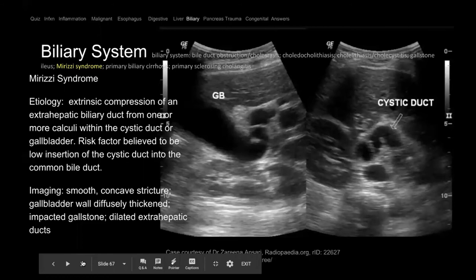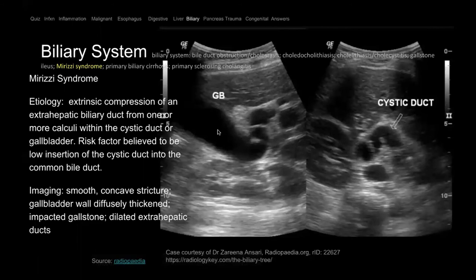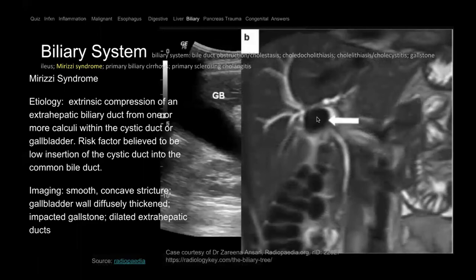Looking at the biliary system — here's an ultrasound of the gallbladder and cystic duct. On MRCP, a ginormous gallstone can cause compression of the adjacent CBD — even though it's not in the CBD itself — causing biliary ductal dilatation. This is called Mirizzi syndrome. Treatment is cholecystectomy.